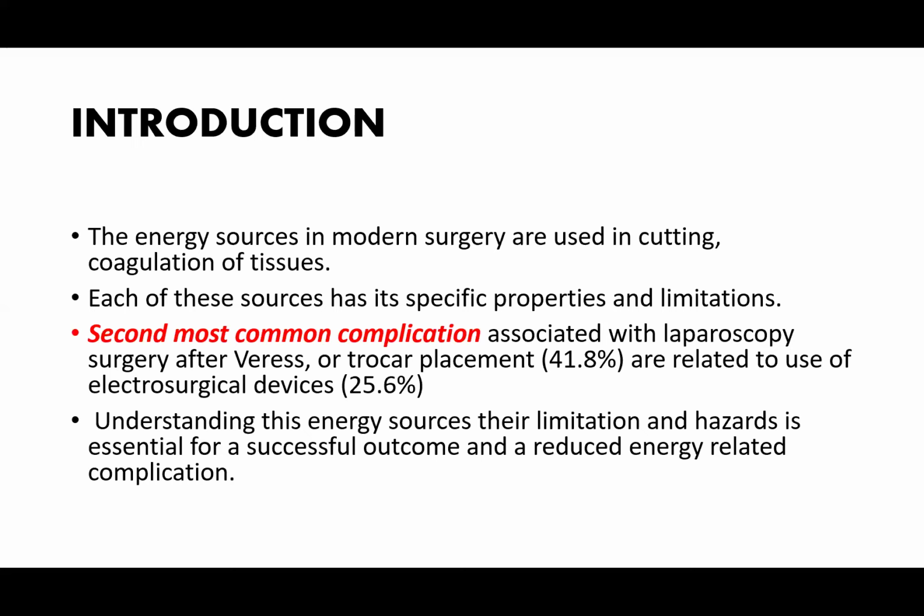During the access, one can injure a major vessel that would warrant opening to secure hemostasis. At the beginning of the procedure, you might just have to abort that procedure and convert to open, struggling with bleeding. Now, the second most common cause of complication is the use of electrosurgical device.